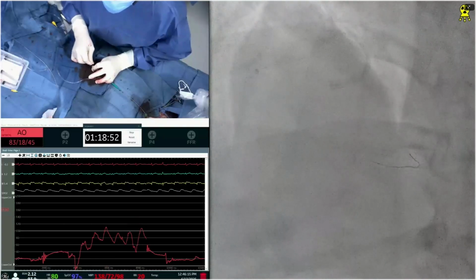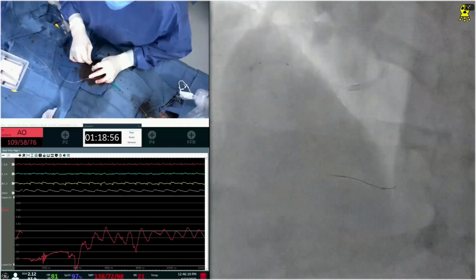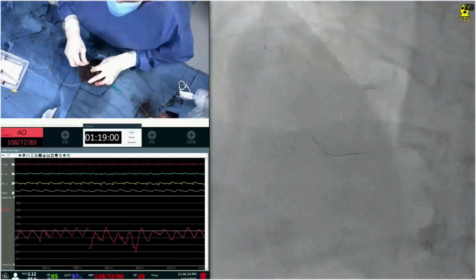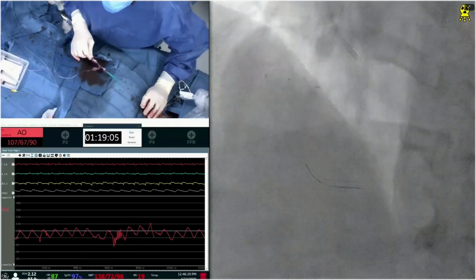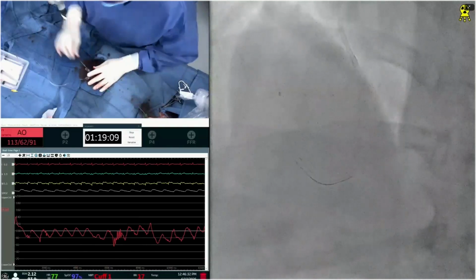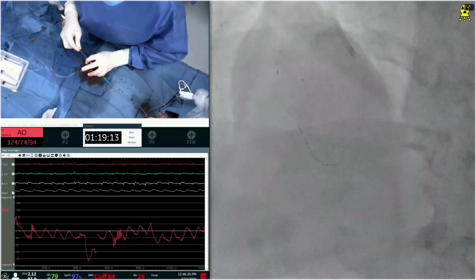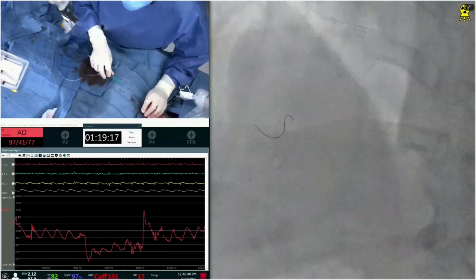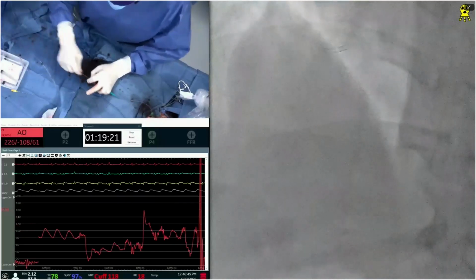Okay, we have to go to the cases. Just one second, go to the step by step. Go up again, that we are struggling, that means it's the same thing again. We're learning. All right, I think we have a reasonable case where we try to show everything possible, except that now the guide we need to change more than anything else, because anything we tried did not work out. Okay, I would start with everything brand new, besides the guide. Start brand new, that's it.